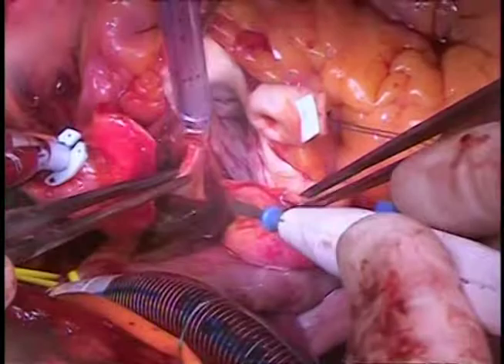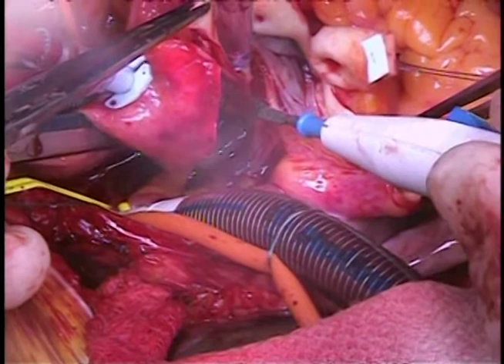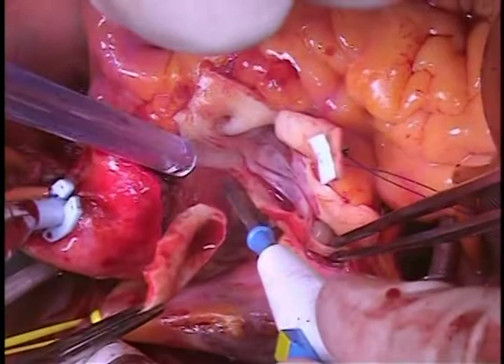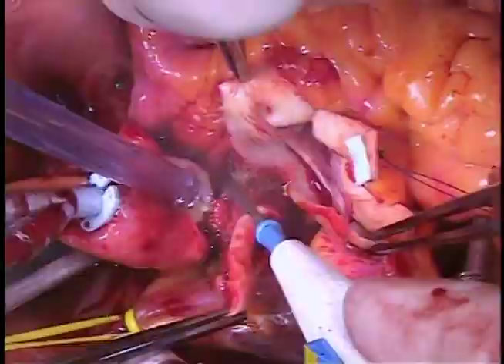It's not possible to get under the right coronary artery until the right coronary button is made. At this point, we make our two coronary buttons and obtain about a centimeter and a half to two centimeters of length as you would for a standard Bentall. However, you need to be cognizant of the fact that you need at least 10 millimeters of sinus tissue to re-implant the sinuses, so don't make the button overly generous.